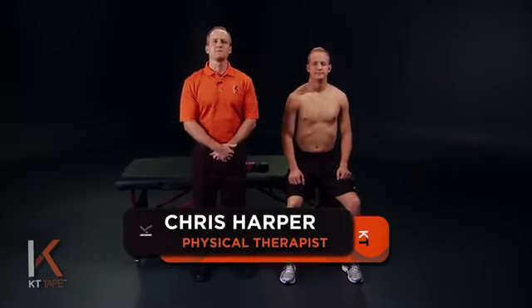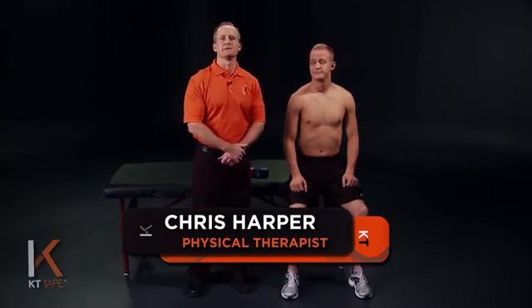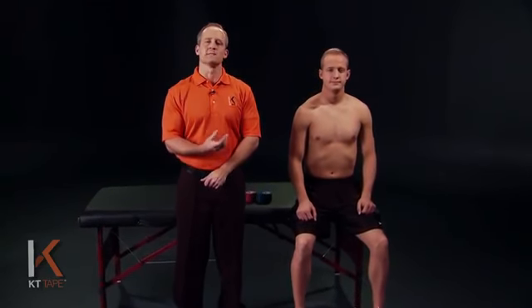Hi, I'm Chris Harper, and with me here is John, and we're here to demonstrate an application for neck pain. This is when you have pain at the base and along the back of the neck.